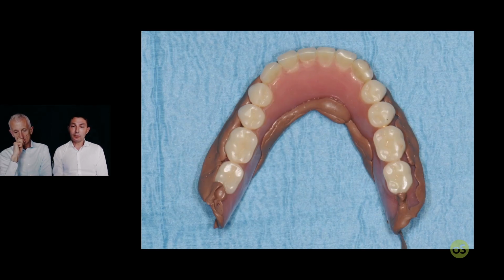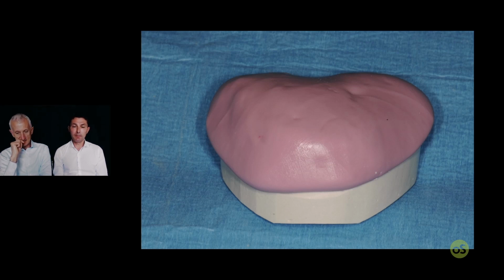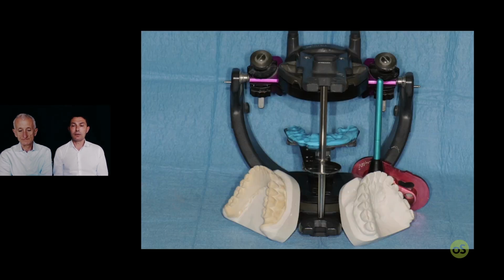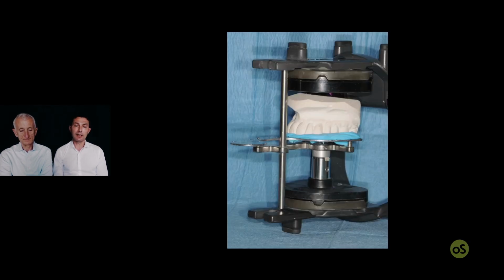Why the step to achieve the duplicate of the prosthesis? Some reline material in the prosthesis. With the plaster, develop the model, and with the silicone, put on the prosthesis in order to obtain the volume of the prosthesis. After the curing, open the mask, remove the prosthesis from the patient, and now I place some other plaster inside the pink silicone and press in the master cast. Now it's very easy to have a duplicate of the prosthesis made by plaster.